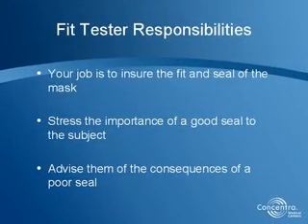Your job is to ensure the fit and seal of that mask. Stress the importance of a good seal to the subject. Advise them of the consequences of a poor seal. They may not develop any problems immediately, but down the road they may develop some serious lung issues.